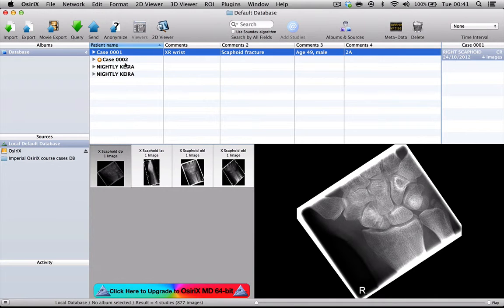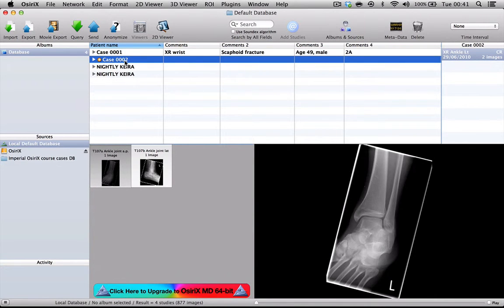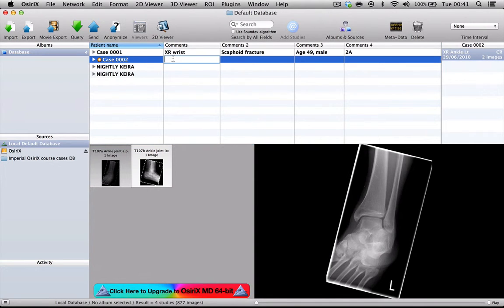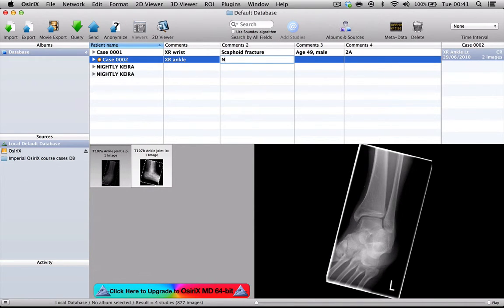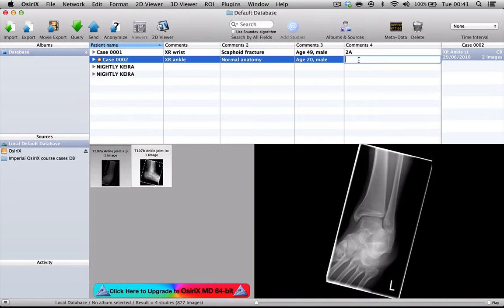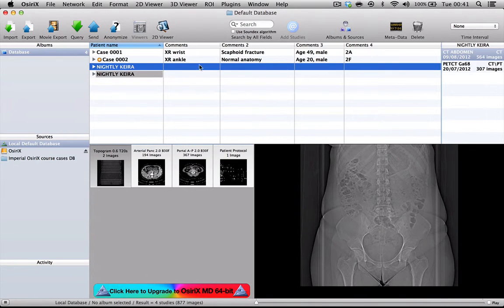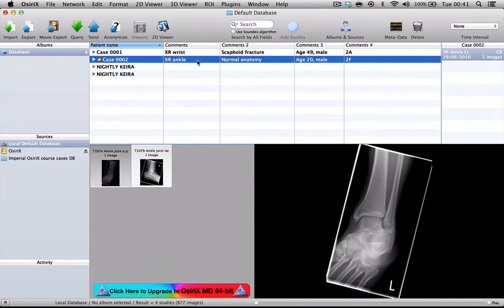At this point, I'll apply those changes and now I've got an anonymized case. It's got rid of the patient identifiers. I can now do the same thing. I'll get x-ray ankle, and this is a normal anatomy case. This was a 20-year-old male. It's always a little bit difficult to know what normal anatomy is in the RCR code, but I'll put 2F for miscellaneous. There we go. That's really quite quick and straightforward and easy, and has the benefit of us having checked the metadata DICOM header fields as we went along.